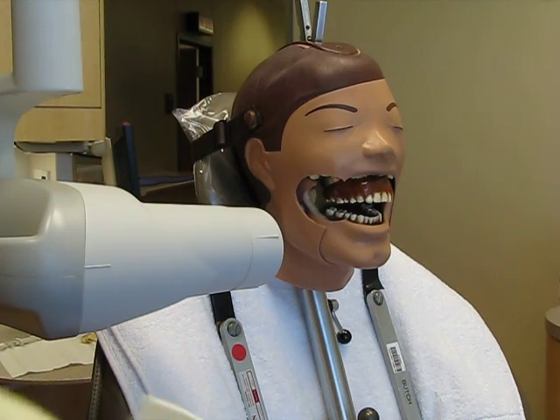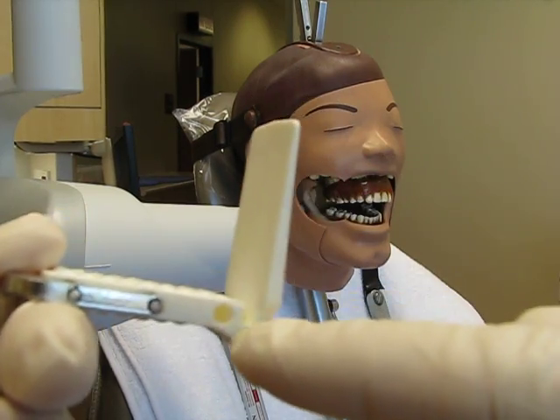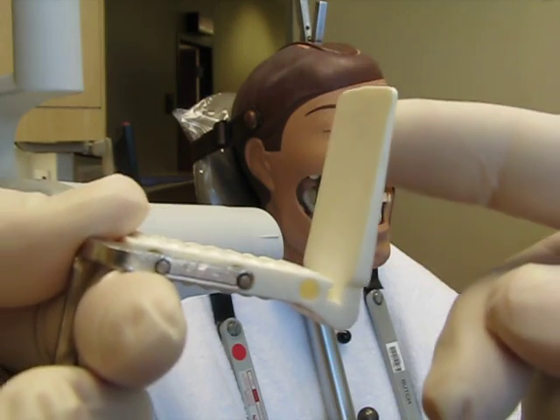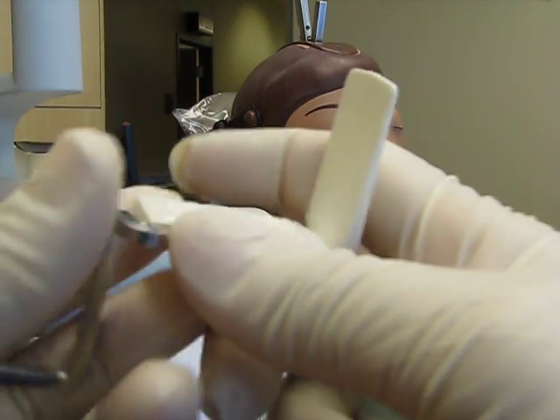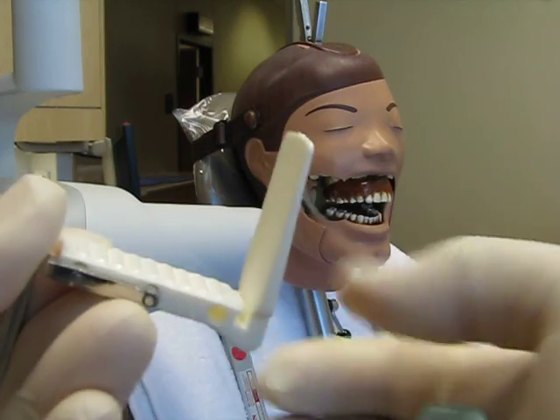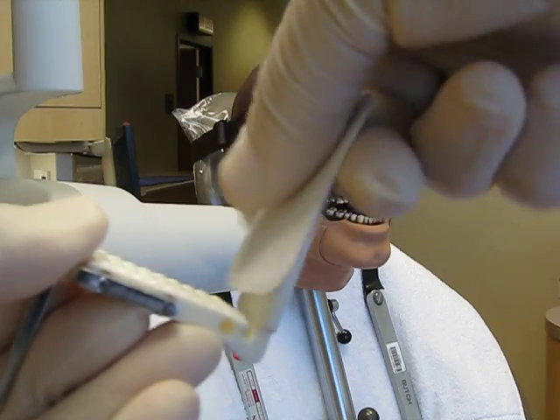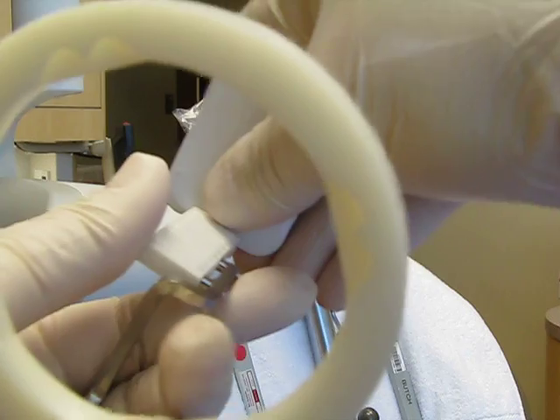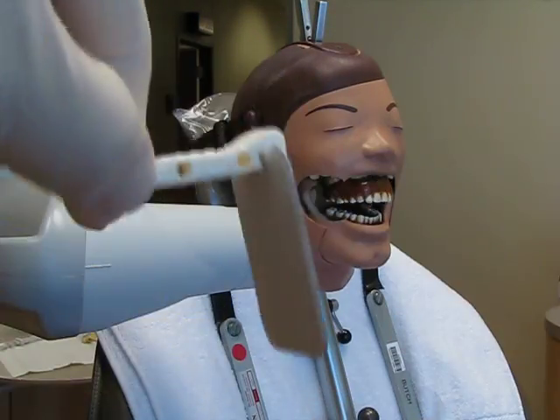down in the slot. And everyone's saying, what's the slot? This is the slot right here. This is the part that you would place it in there, okay? Sometimes the bite tab is a little loose and the film falls out. All you have to do is tighten this by pushing this forward with no film in there, okay? Then you pull the bite stay back a little bit, and slide your film in, okay? And voila, there you go. Film doesn't come out.